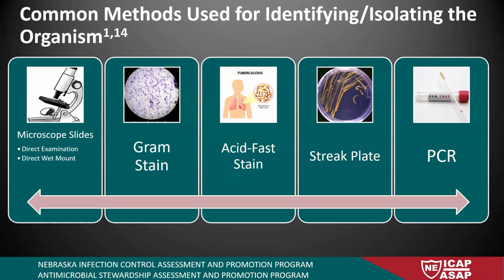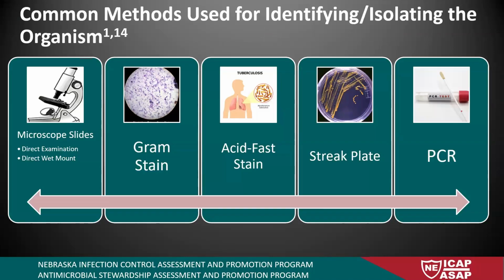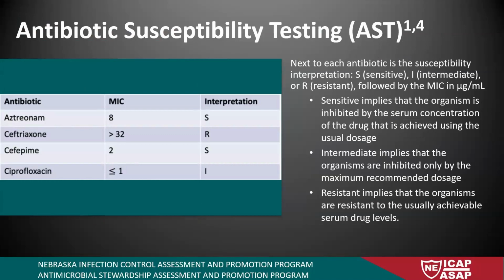But this is an example of what a MRSA blood test would look like. I don't know if it took me a while to realize this when I first got into infection control, but I was always looking for it to say methicillin resistant, and it doesn't. That's not the antibiotic they're going to pick out on the lab. It's oxacillin. So if something is resistant to oxacillin, that's what you're looking for when it has to do with MRSA. No one ever told me that. They don't ever result methicillin on a culture report.